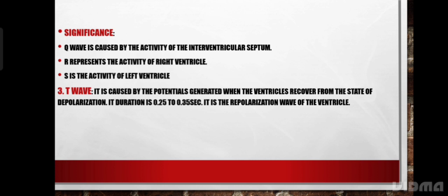Third, T wave. It is caused by the potential generated when the ventricle recovers from the state of depolarization. Its duration is about 0.25 to 0.35 seconds. It is a repolarization wave of ventricle.